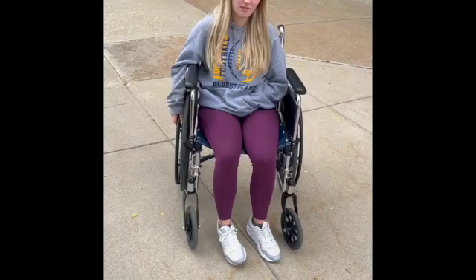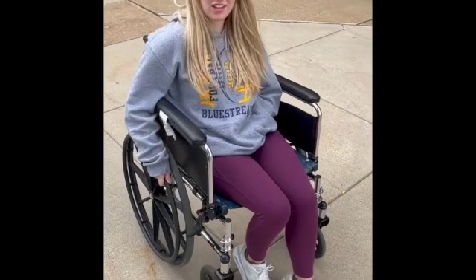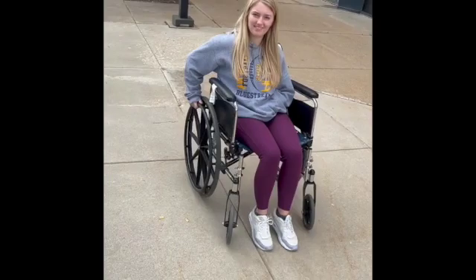Emily experienced a bad accident where she got her arm bit off by a velociraptor, so she's going to show you how to do it one-handed. With one arm, you still move your hand with the wheel, but you guide yourself with your legs. To turn, you use the wheel and your legs together.